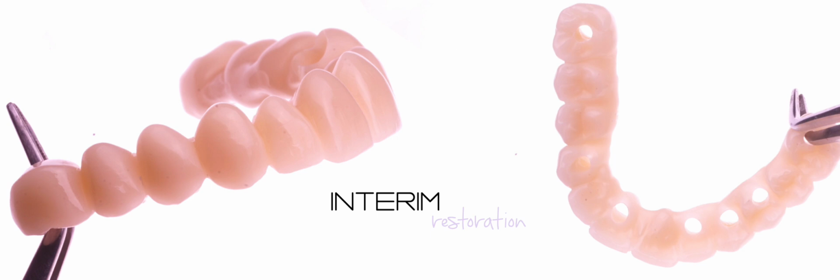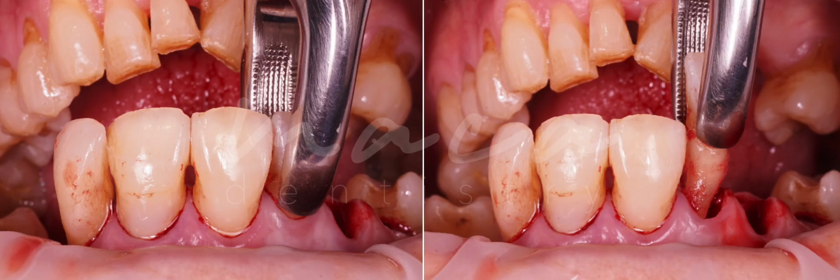So, as we mentioned previously, in this case we also plan to do immediate loading, and in order to do that, the lab fabricated this interim prosthesis according to the previously approved mock-up. The provisional restoration was milled from a PMMA disc. So, we have the guide, we have the provisional restoration, we can go for the surgery.